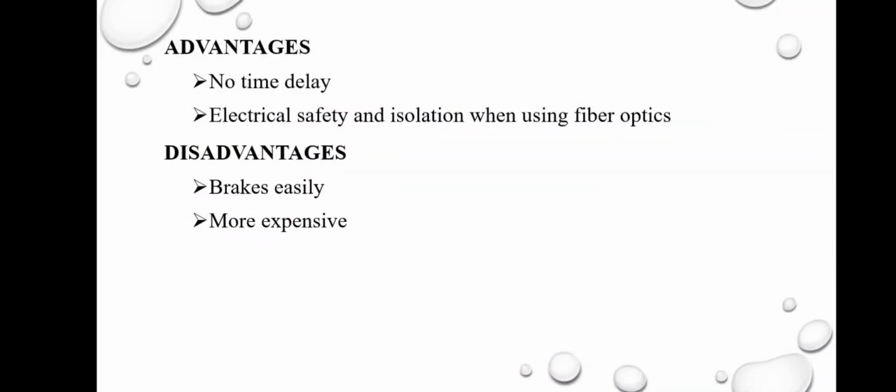The advantages are no time delay, and electrical safety and isolation when using fiber optics. The disadvantages are that it breaks easily and is more expensive.